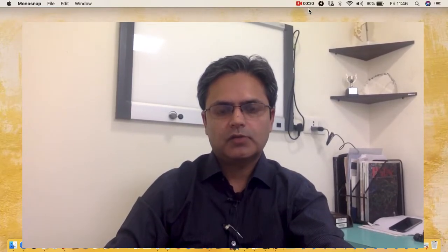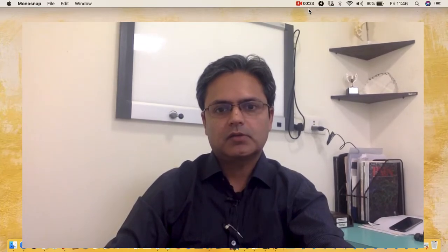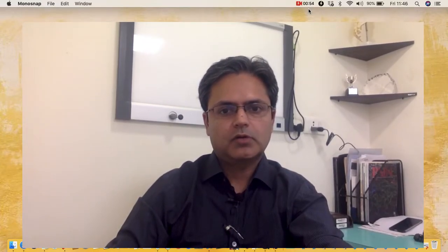So, the topic for today's presentation is C-arm image optimization and radiation safety. I selected this topic because last month was September, which is the Pain Awareness Month. And I know a lot of pain physicians have worked hard to create awareness about various pain conditions and their management options. So I thought, what better to follow in the month of October than to discuss something which is relevant not only for our patients, but also for our personal protection, as in the pain physicians and their protection. This is something which is not very well covered in various training programs and is often ignored by pain physicians. So I thought it's important to talk about this.